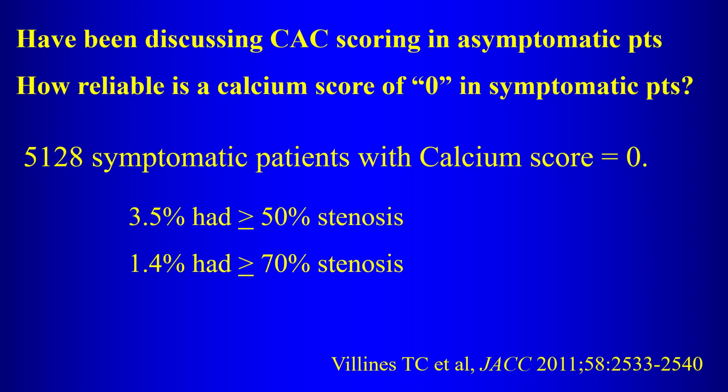So in patients who are symptomatic, there can be, albeit a low percentage, patients with a calcium score of 0 that can have significant coronary artery disease. So a calcium score of 0 in symptomatic patients does not guarantee that the patient does not have significant coronary artery disease.